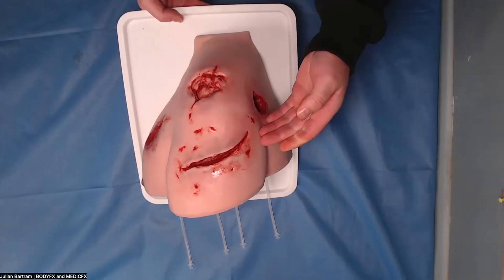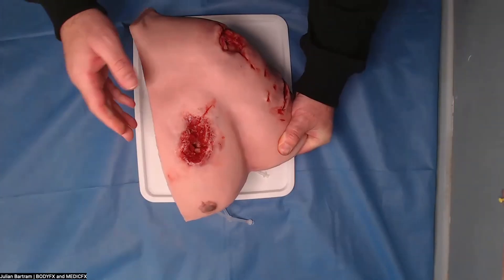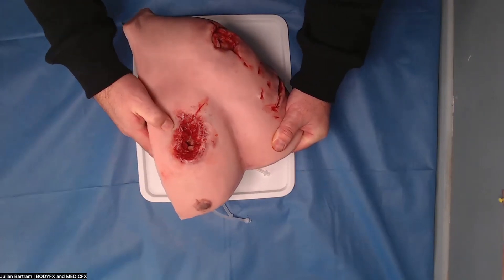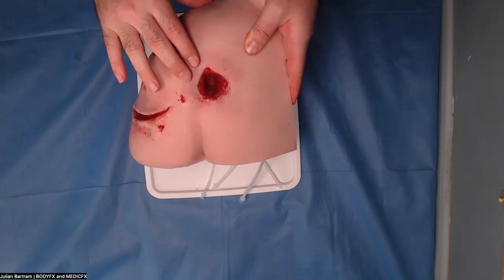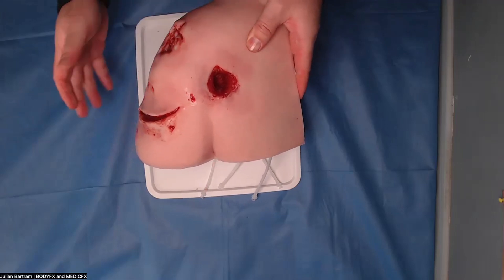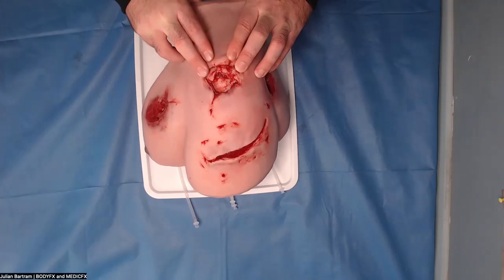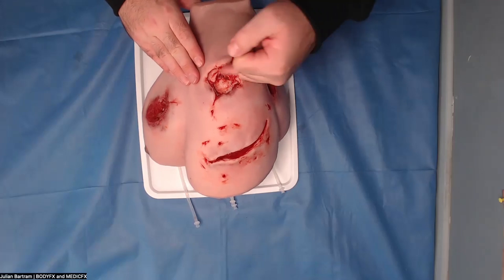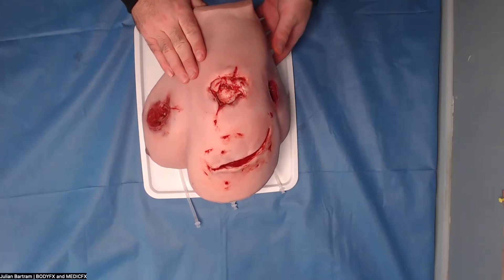Here we have a large laceration to the side of the arm, a large blast type wound on the front here, either an entry or exit wound for a bullet or similar penetrating injury, along with maybe an explosion or another penetrating injury of some description to the shoulder. You can see the humeral head here in the top of the wound.